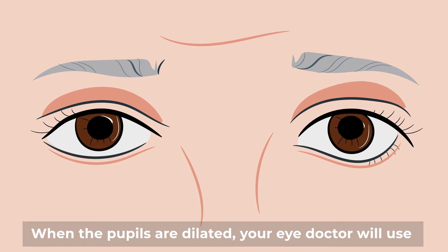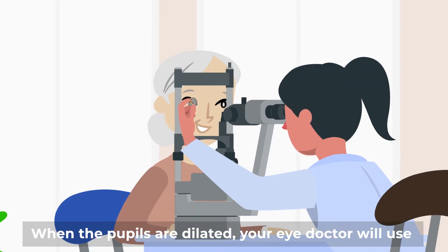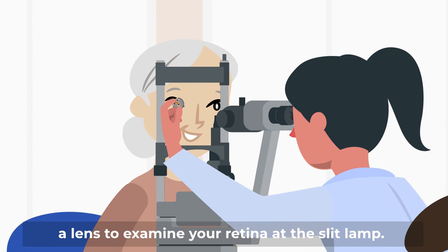When the pupils are dilated, your eye doctor will use a lens to examine your retina at the slit lamp.